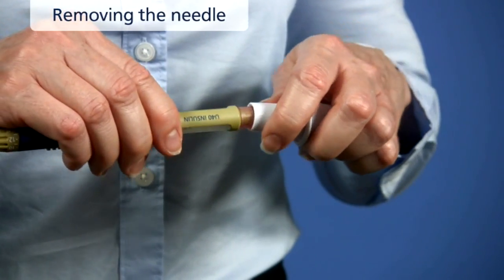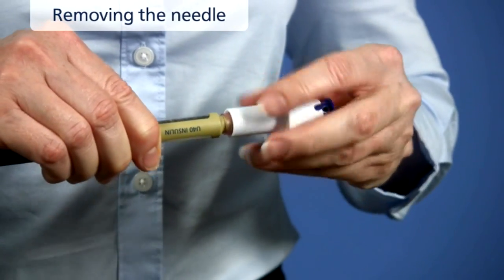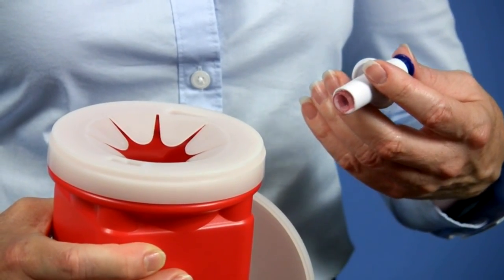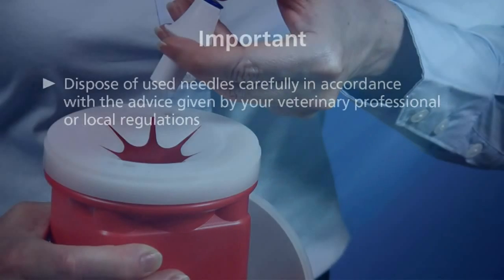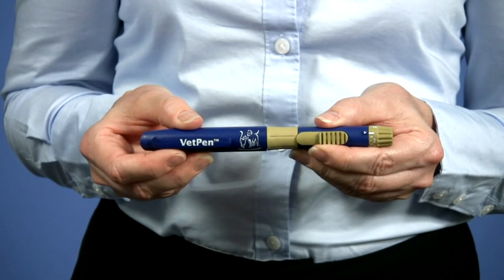After completing the injection, remove the needle by inserting it in the needle remover and unscrewing it. Press the blue tip on the needle remover to release the needle. Always check to make sure the pen needle has been removed. Dispose of used needles carefully in accordance with the advice given by your veterinary professional or local regulations. Replace the pen cap onto VetPen.